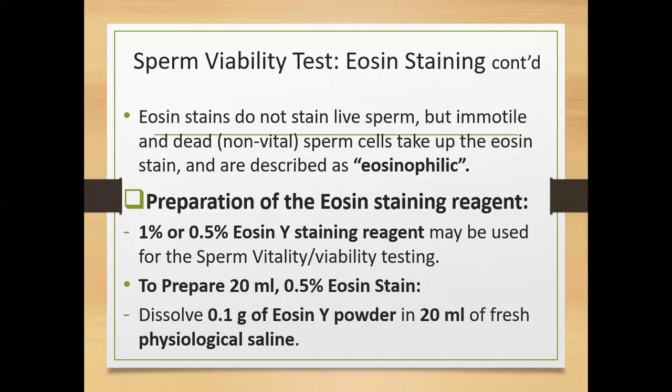So if there's water in the environment, water in the medium, water will move into the cell. Once water moves into the cell, the tail will begin to swell.